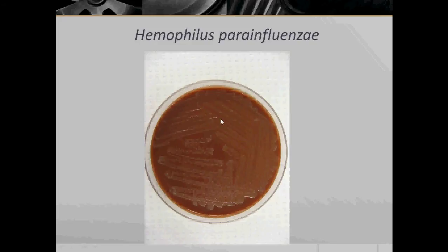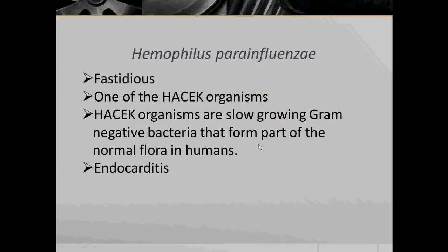Here we see Haemophilus parainfluenzae growing on chocolate agar. Haemophilus parainfluenzae are fastidious and are one of the HACEK organisms. HACEK refers to a grouping of Gram-negative bacilli where each letter represents a different bacterial species: H represents Haemophilus species, A represents Actinobacillus actinomycetemcomitans, and C represents Cardiobacterium hominis.